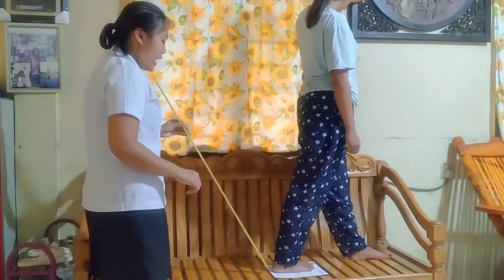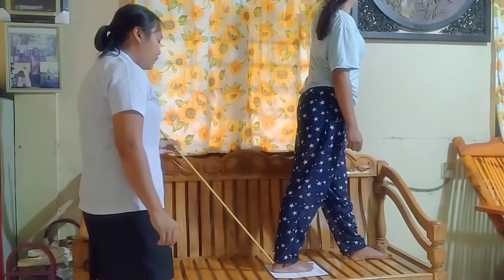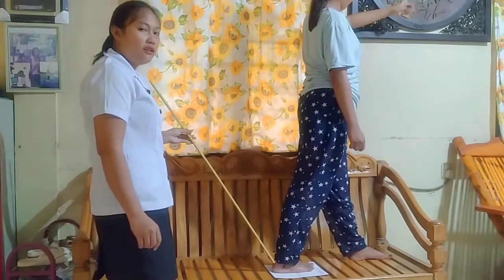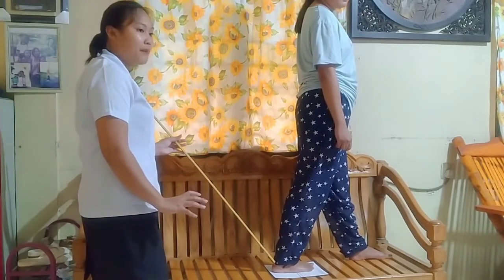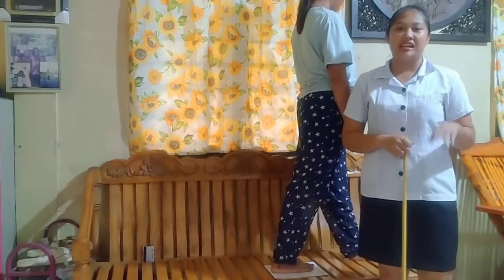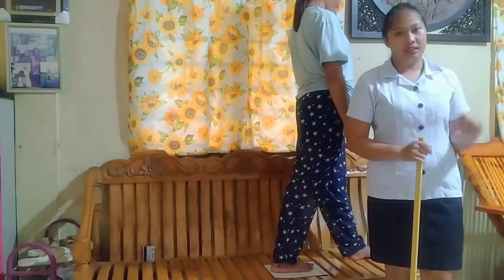And the central ray will be 25 degrees, directed posterior aspect of the ankle. Okay. This shows the entire foot free from the lower leg.